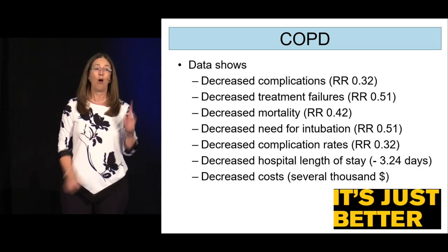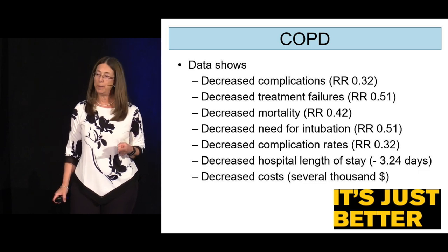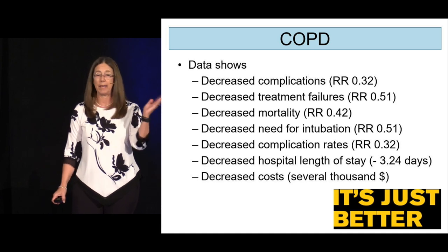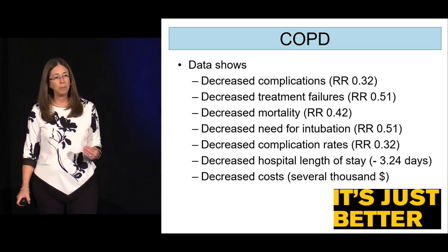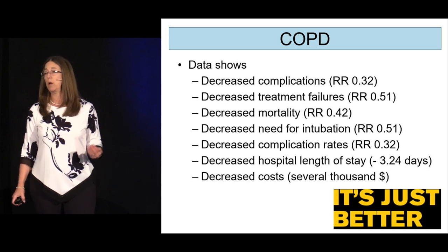First, I want to say it again, first-line therapy. So you have somebody with moderate to severe COPD exacerbation, you're going to get this thing out and you're going to plug them in. And remember, you're going to pick like 8 over 3 or 10 over 5, and you're going to watch them and see how they do. But this is so incredibly successful in COPD patients. It is remarkable what it will do.